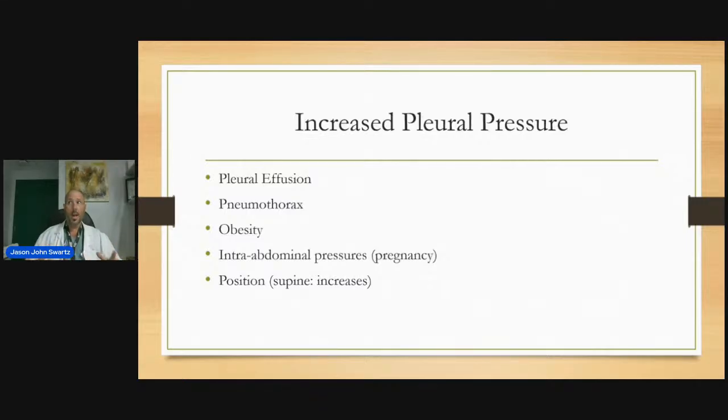Because if we're not, for example, like you have a patient that's 7 liters fluid positive, you see their arms are swollen like this, they're as hard as the table. Now, do you think that applying a pressure plateau of 30 perhaps is as applicable to somebody that isn't 7 liters fluid positive?